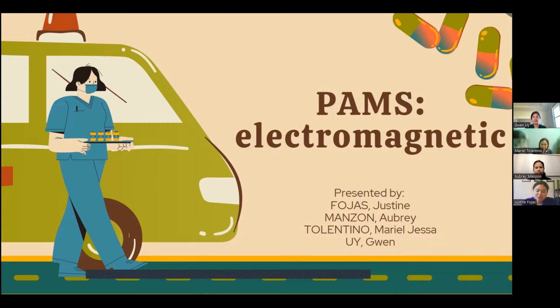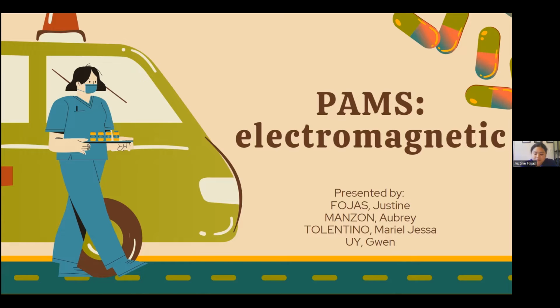Before we start, we are just going to discuss briefly what the electromagnetic PAMs are. These are the ones that use electricity and the electromagnetic spectrum to facilitate tissue healing, improve muscle strength and endurance, decrease edema, modulate pain, decrease the inflammatory process, and modify the healing process. Our group is going to discuss four electromagnetic agents.